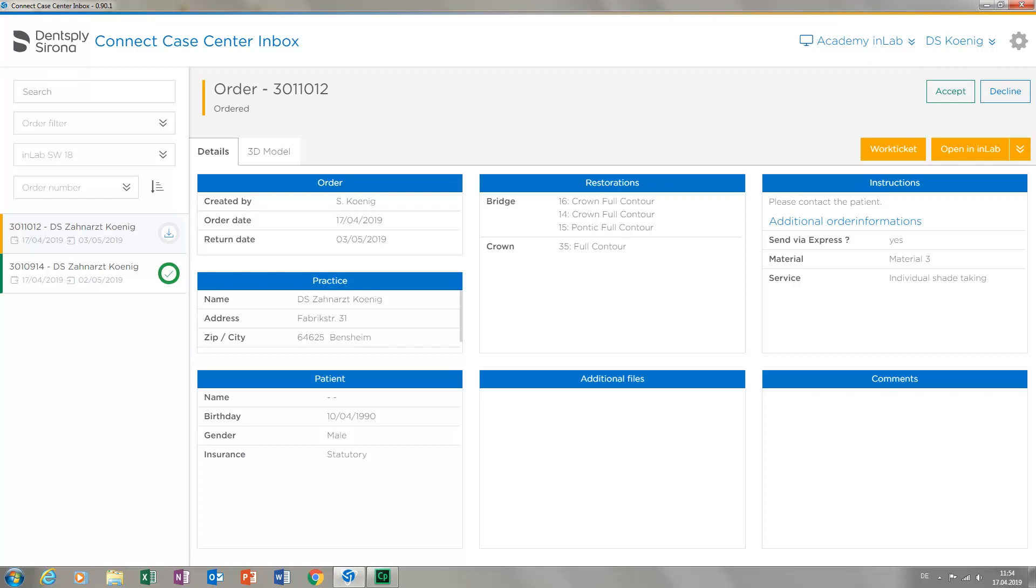Theoretically, you could let the ordering dentist know right now whether you will accept or decline the case. Before you do so, you can open the 3D model of the case in your inbox and check preparations or transmitted preparation margins.